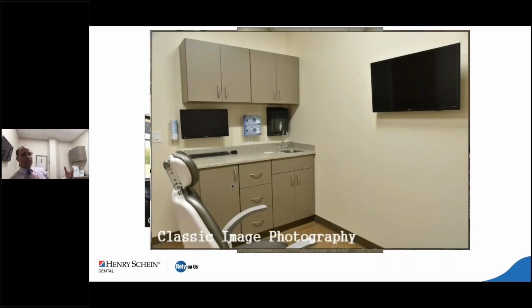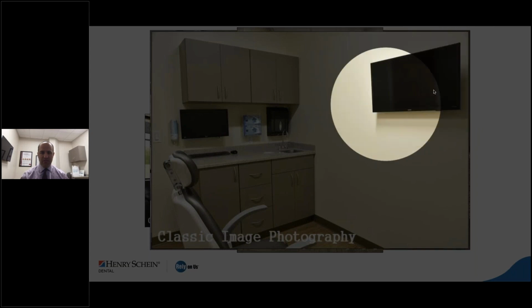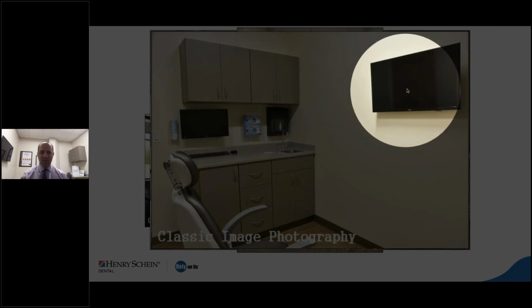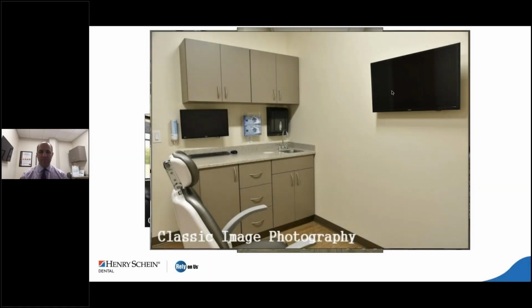You can see behind me, we have a dental chair that folds all the way back, and the leg comes up a little bit, which is nice, but it sits upright, which is how most of my conversations are. Then we have a monitor for the patient so we can pull up their sleep study and go through it with them, pull up their imaging, their posture photos, and so on. We just have slow speed Dremels in each room. This room in the corner has a high-speed handpiece, the only room in our office that has that.